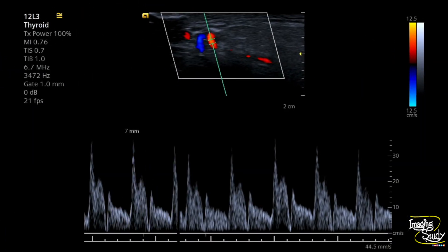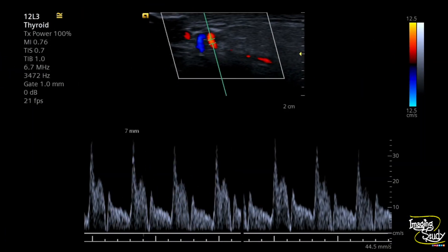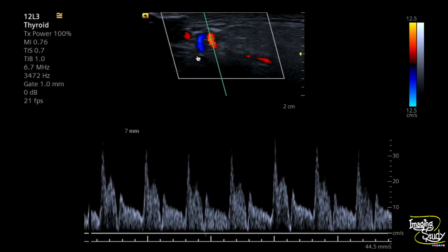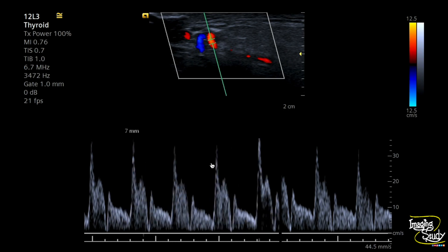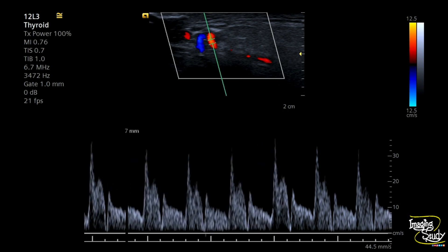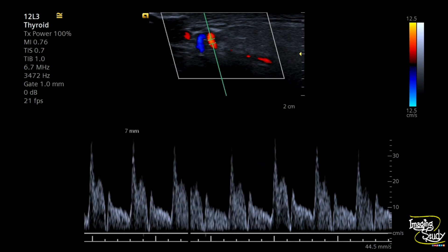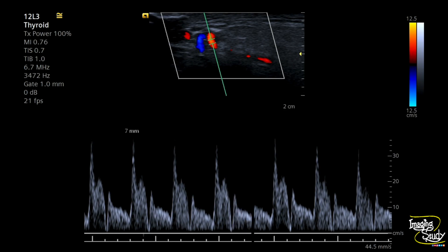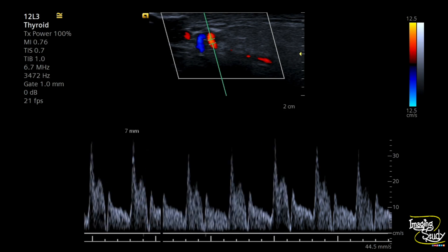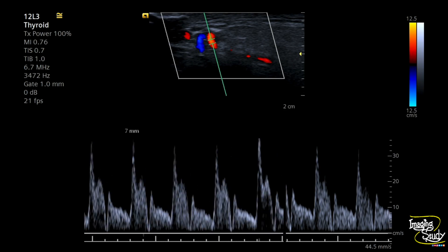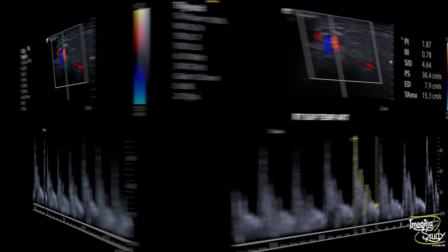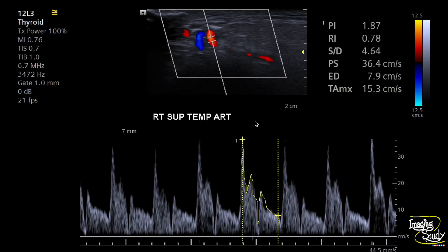Now let's look at the spectral Doppler. Here on the spectral Doppler from the most dilated part of the lumen, you can see it is showing a normal flow velocity of the superficial temporal artery with a good amount of diastolic component. The peak systolic velocity was around 36 cm per second.